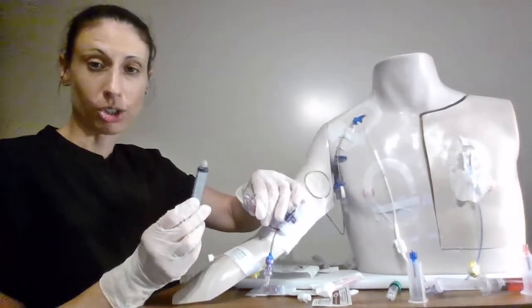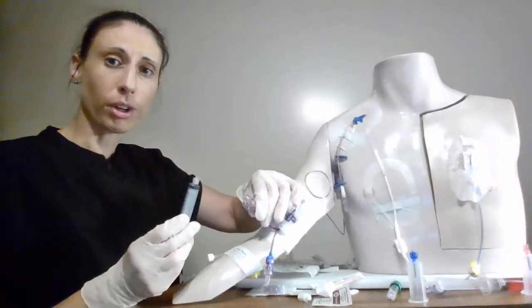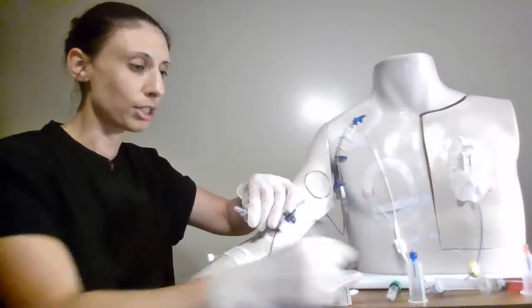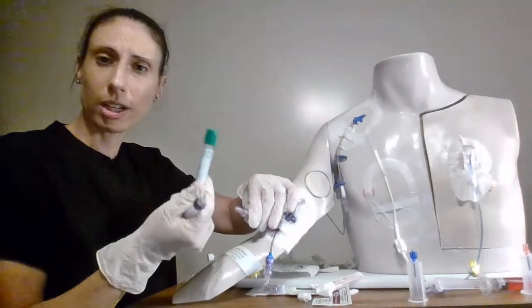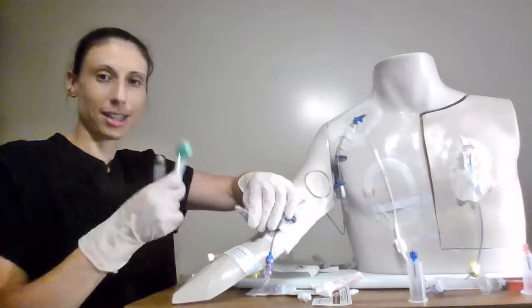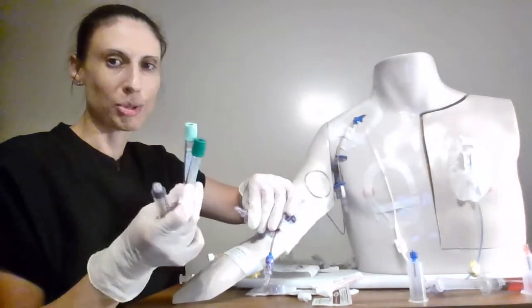So we would take a 10 cc syringe. You could use a smaller syringe if you want to. It depends how much blood work you're taking. So if you were only taking say one tube this tube needs 4 mLs so I could use a 5 mL syringe. If I'm taking two tubes say these sizes I would probably need about 10 cc's.